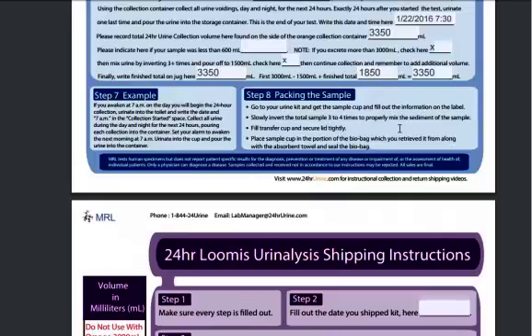Some people put multiple samples in these. Okay, so before you pour off, you always want to invert. You always want to mix it up. The inverting is just turning it over, rocking it upside down in there. Hold on to that cap. You don't want to spill it.